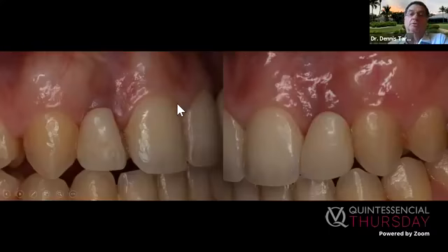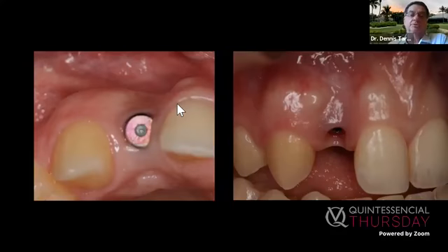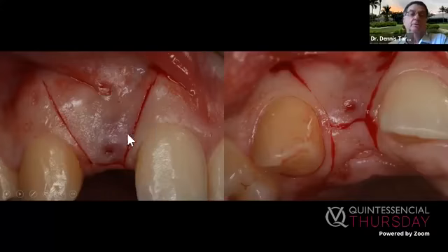So take a look at depression. I'll go through this quickly. So what did we do? Decoronation. Okay, let's look at what happened. There's a decoronation. Now we let it sit for 3 weeks. Now notice there's always a hole there. See? But now I have some extra tissue. I can go apical to that at the crest and move that tissue out.